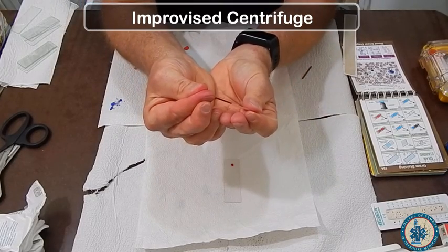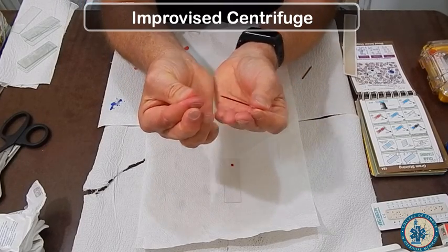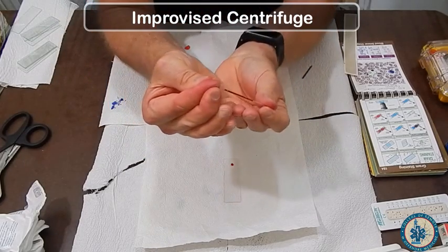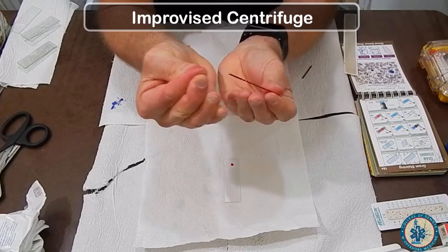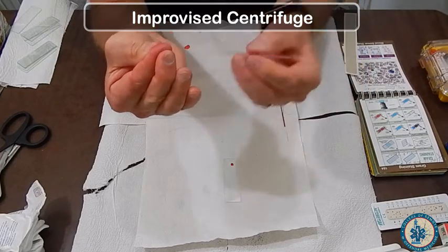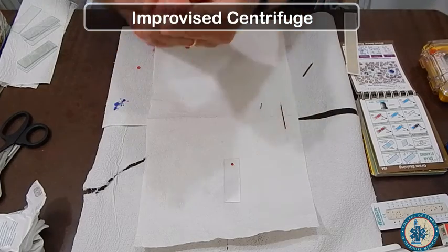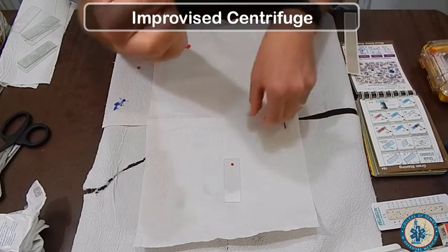Milk your finger and get some more blood out. Notice the capillary tube is below the blood and it will fill using capillary action. Get a second tube if needed — it's always good to do two to balance your centrifuge.